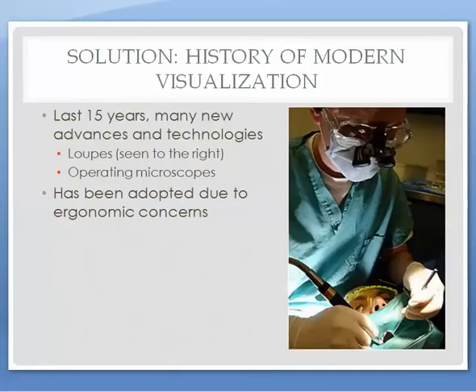The solution to these gaps came in the form of advances in magnification and visualization technologies over the past 15 years. Primarily loupes, as seen in the picture to the right, and operating microscopes. These two tools address technical issues as well as ergonomic ones, resulting in their quick adoption.